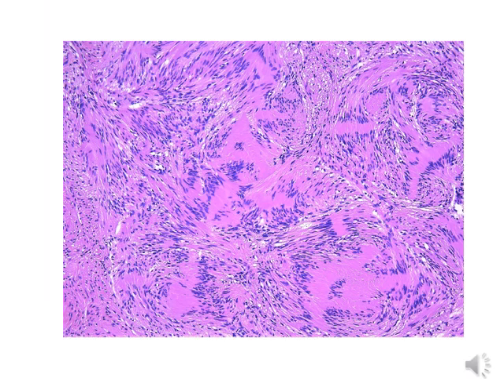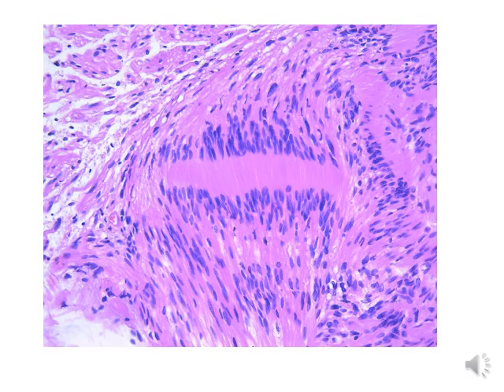Another picture for microscopic findings of schwannoma, showing here the characteristic palisading pattern of Antoni A. The haphazardly arranged areas are called Antoni B. A focus of the palisading pattern of the spindle cells or Schwann cells here, showing the parallelly or palisading arranged wavy nuclei of the spindle cells.